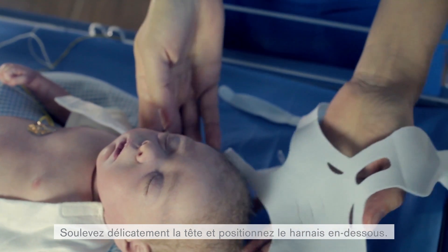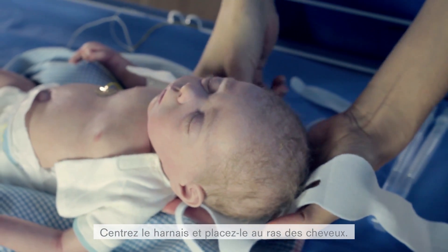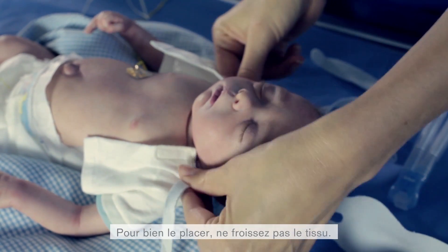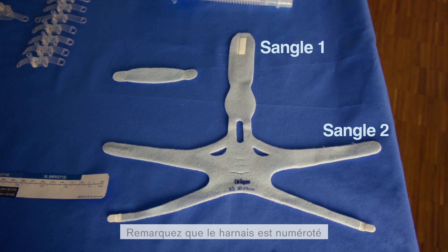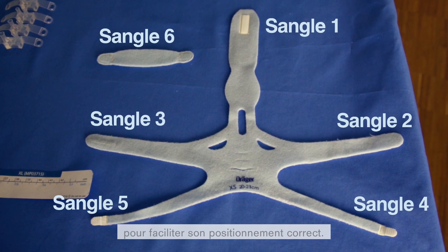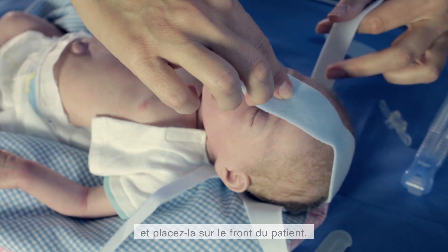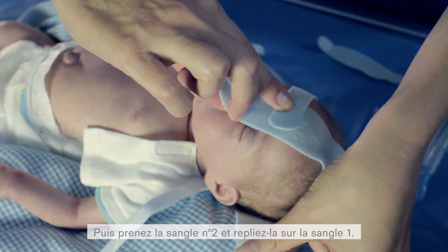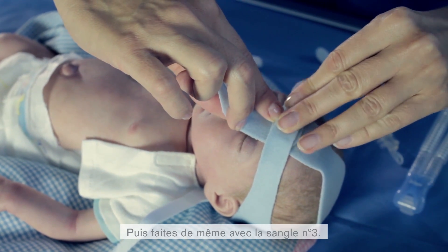Gently lift the patient's head and position the headgear underneath. Ensure that the headgear is centered and positioned directly on the hairline. For best positioning, avoid wrinkling the material. Notice the headgear is labeled with numbers to help assist you in securing the accessory correctly. First, take the middle strap, number 1, and put it over the patient's forehead. Then take strap number 2 and fold it over the top of strap 1. Then take strap number 3 and do the same.